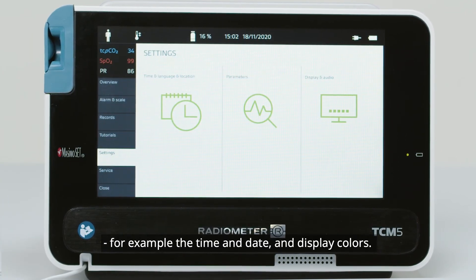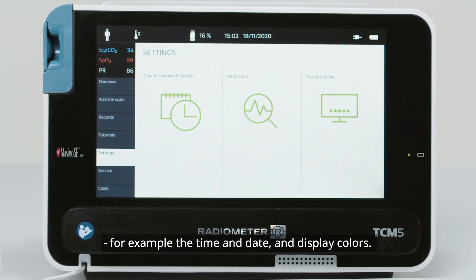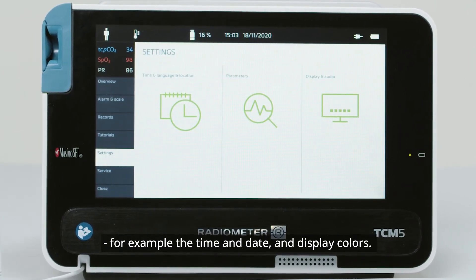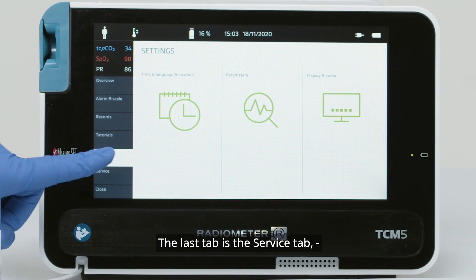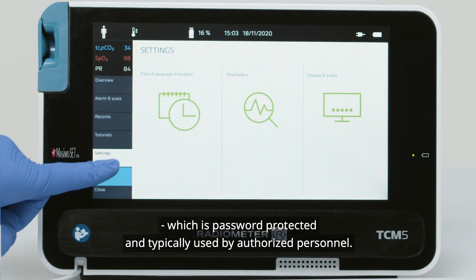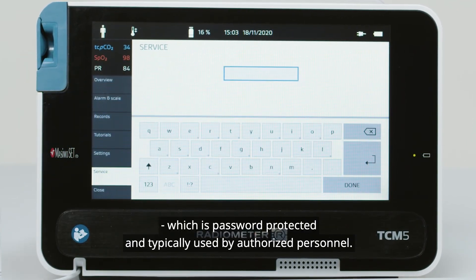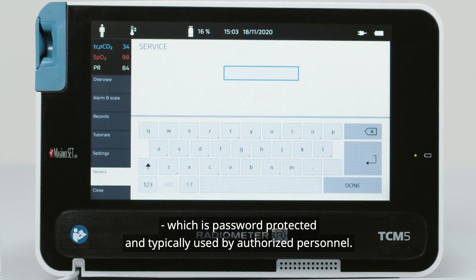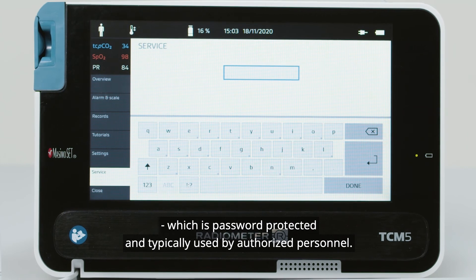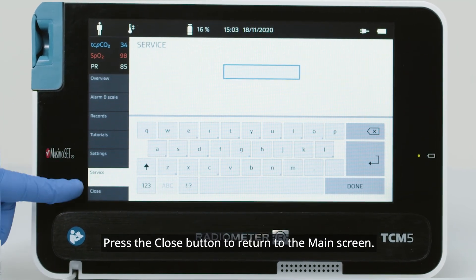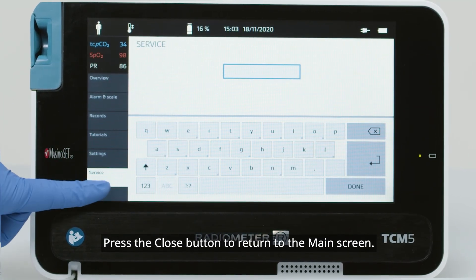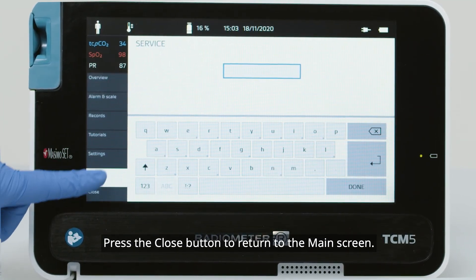The Settings tab enables editing and customization of the monitor, for example the time and date, and display colors. The last tab is the Service tab, which is password protected and typically used by authorized personnel. Press the Close button to return to the main screen.